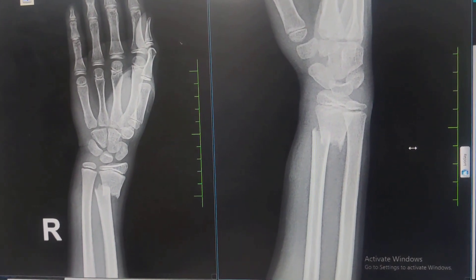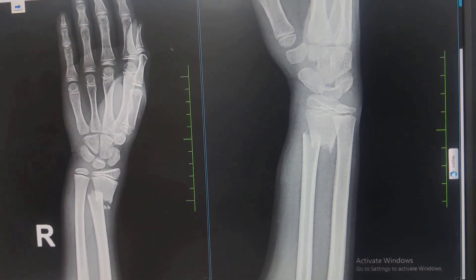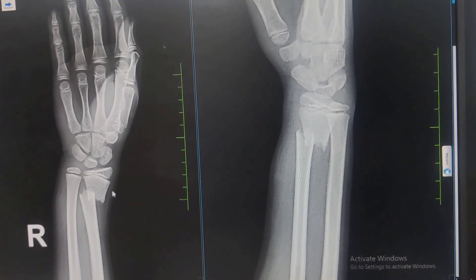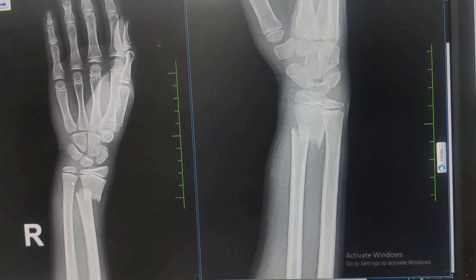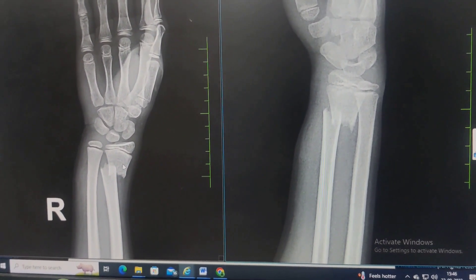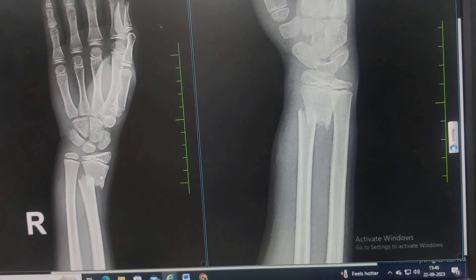This is our patient. He is a 14-year-old boy who unfortunately fell and sustained this injury. This is the typical fracture pattern that you will see — it is usually a transverse fracture with some shortening. Pronator quadratus is attached just across here and it is one of the common structures to get entrapped which prevents reduction, hence some people call it a pronator type fracture as well.